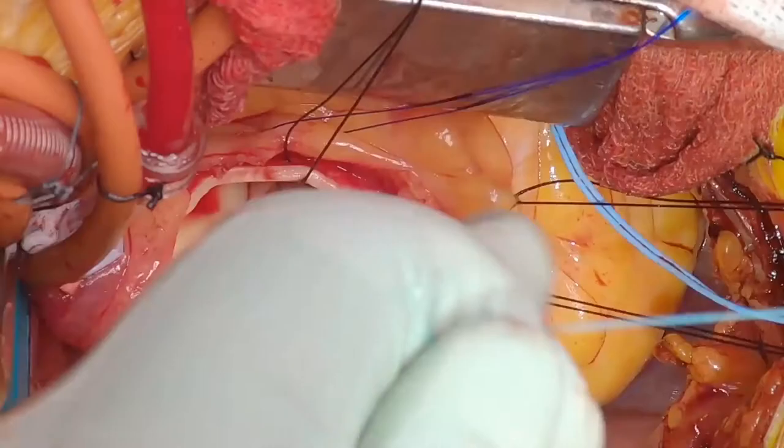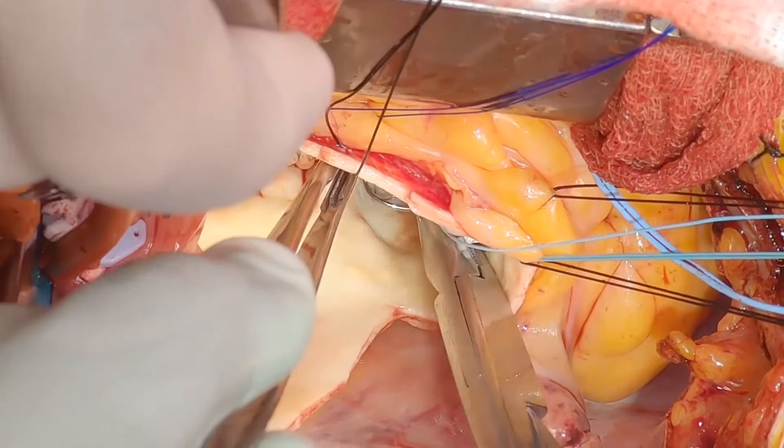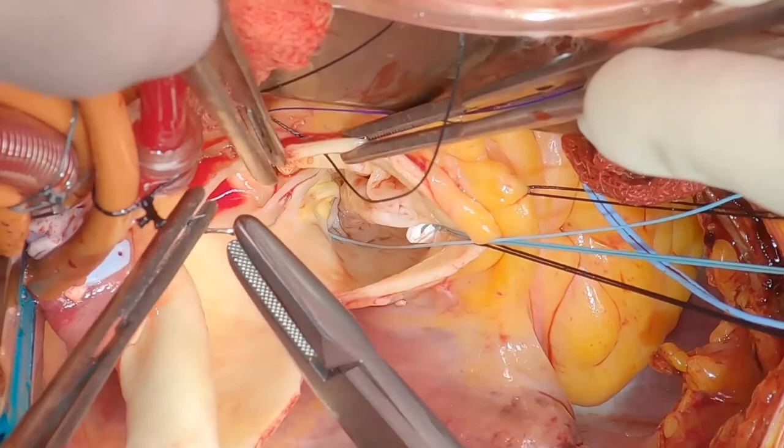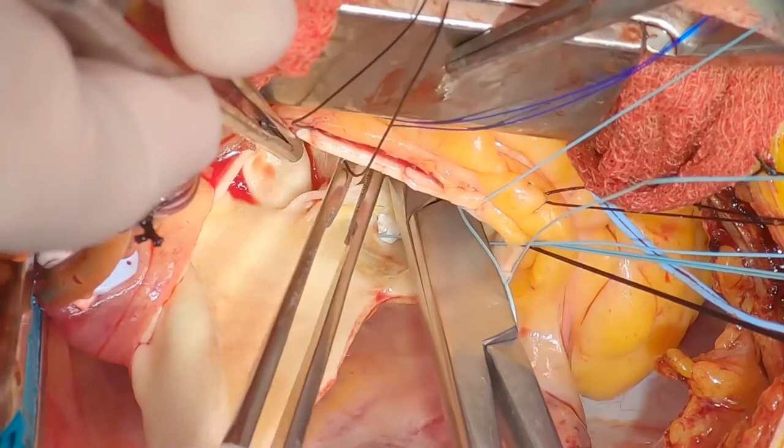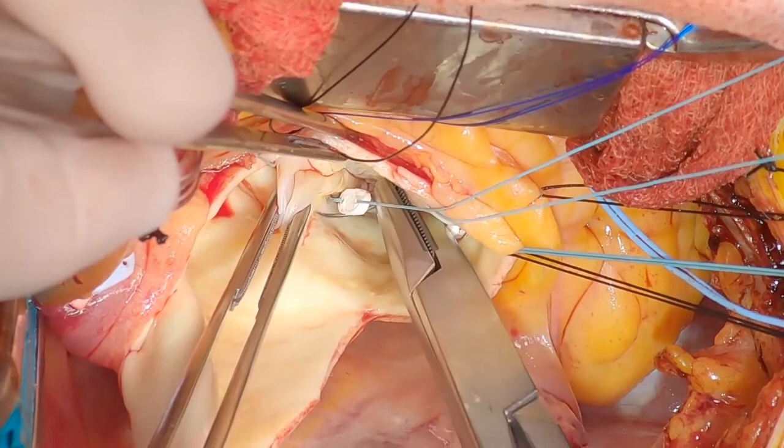From that, you can start estimating what you need to do. I hook this onto my retractor — this is a minimally invasive operation with limited exposure, about a six-centimeter incision. Here's the leaflet being coapted down at the base of the commissures. You've got to watch out for the left main. This is the second valve suture or cabral suture — I always tell the nurse I need the valve sutures so they know this is for the cabral stitch.